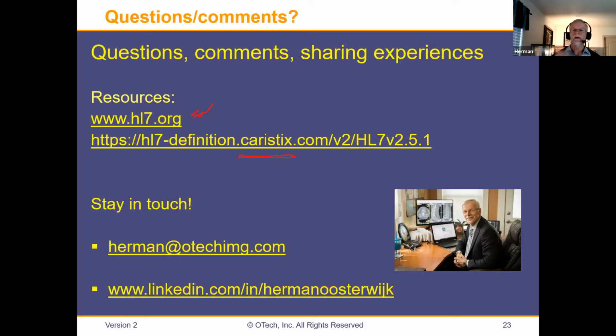So there are two locations. It's called the patient ID, and there's another field called other patient IDs. The idea is that whatever is the primary patient ID, which is the unique key that we use in the PACS system, whether it's a medical record number or whatever, you put that into the patient ID field. And everything else, the whole bunch, you dump together in the other patient IDs, which is actually multi-valued. So we can do 1, 2, 3, 4, 5, and the multi-values are separated by the backslash. So 1, 2, 3, 4, 5, backslash, 6, 7, 8, backslash, and so on. So we map it into the primary patient ID and then other patient IDs.